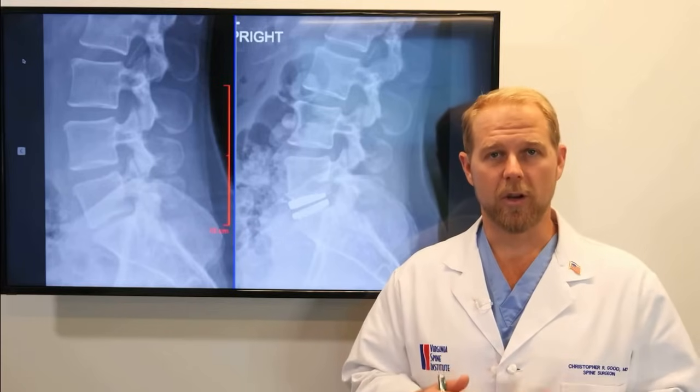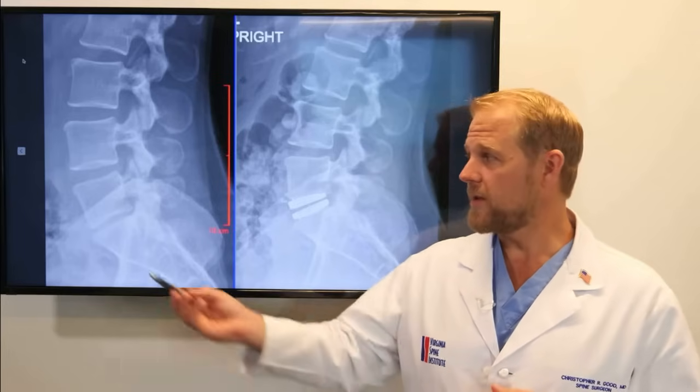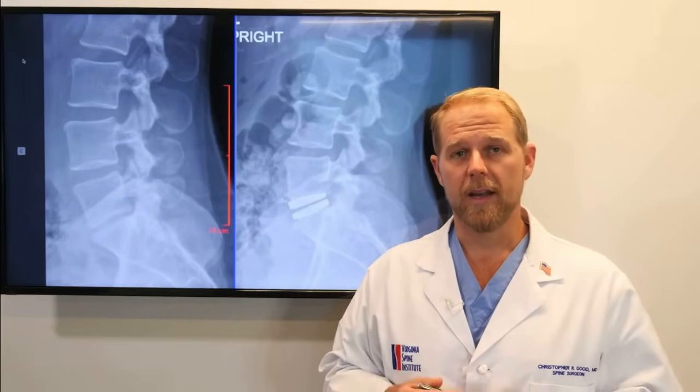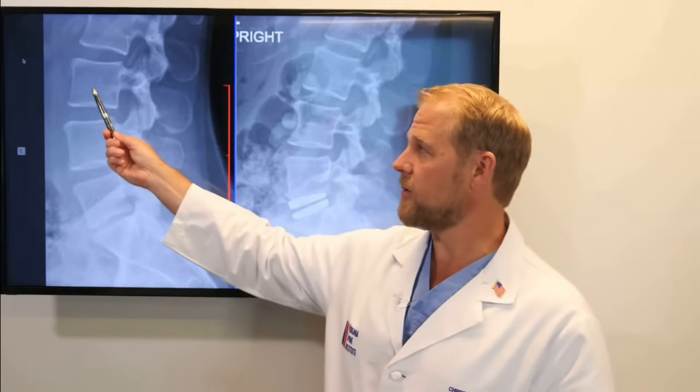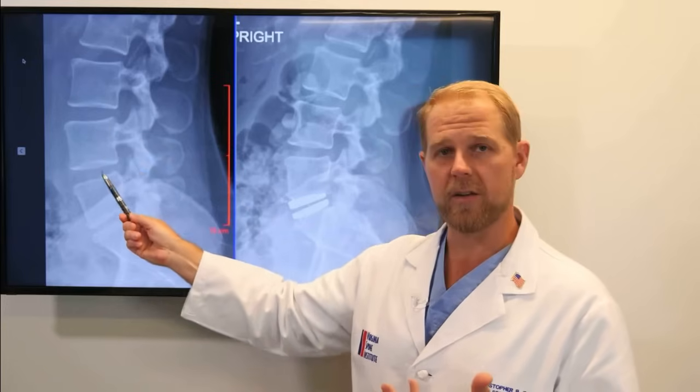I'm going to share with you an example of a lumbar disc replacement and we're going to do this by talking about the x-rays for the patient. What we see here is a side view of the low back or the lumbar spine, and we see that the spine has a series of bones and discs that are stacked one on top of another.